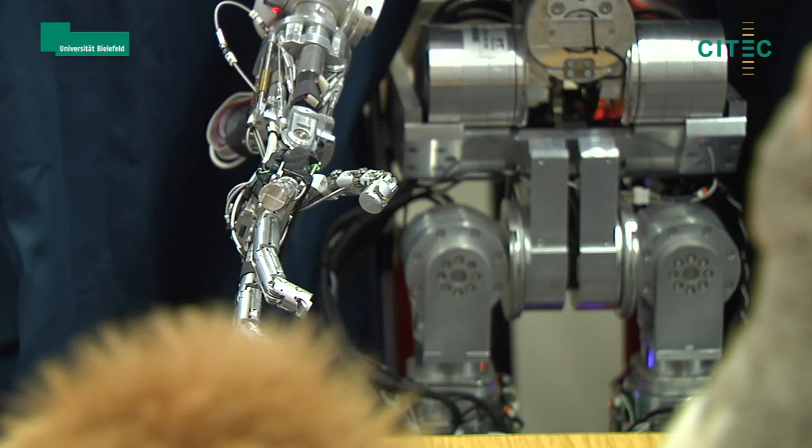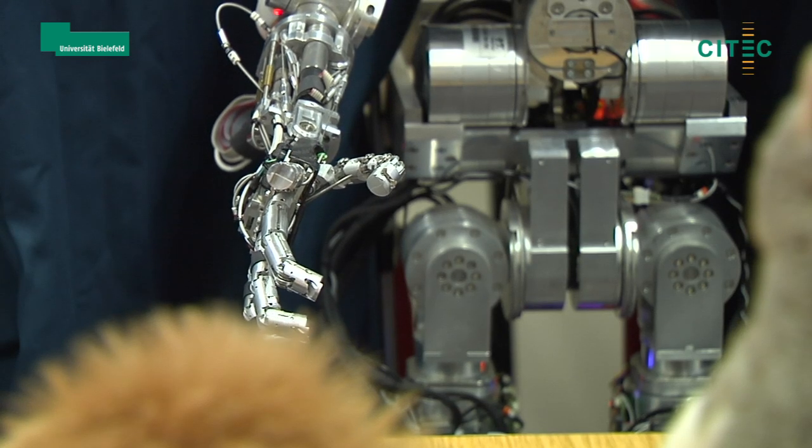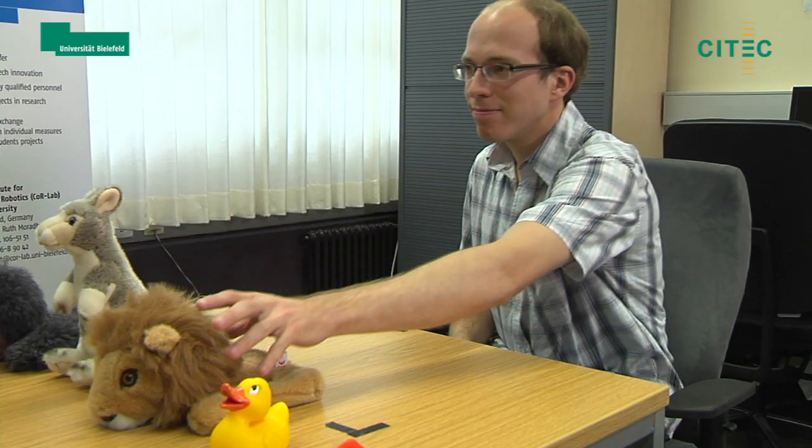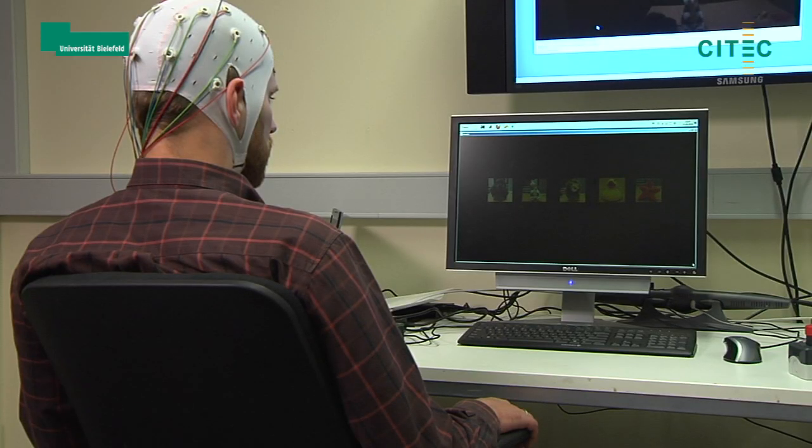iCup points to the toy that the user selected. Then the helper picks up the toy that was selected by the handicapped user.